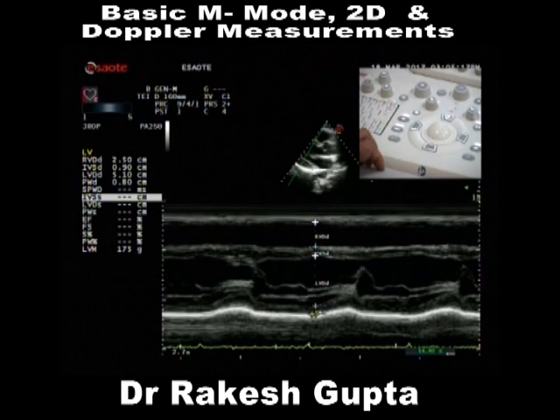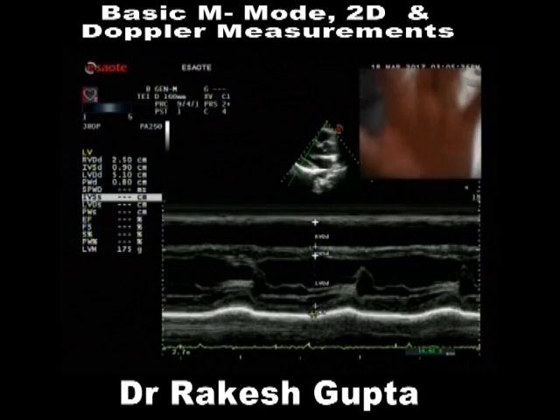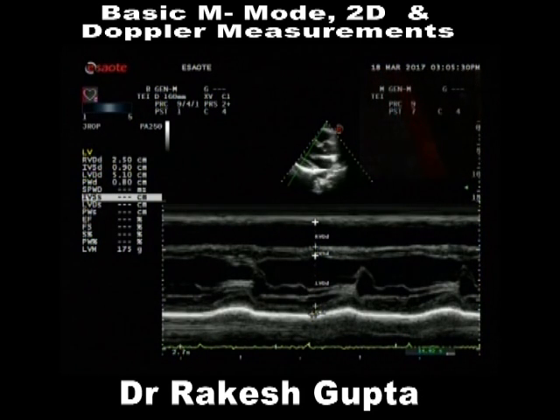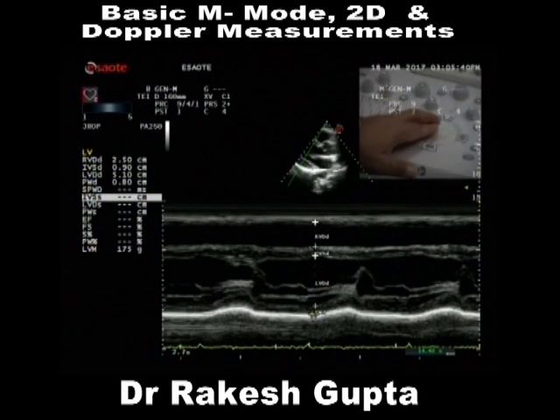So what did it give you? IVS during diastole, posterior wall during diastole, and LV dimension during diastole. And if IVS thickness is more than 12 millimeters, then we say LV hypertrophy. During diastole and systole they will all be thickened. Now, once we have done this, we will go to systole.